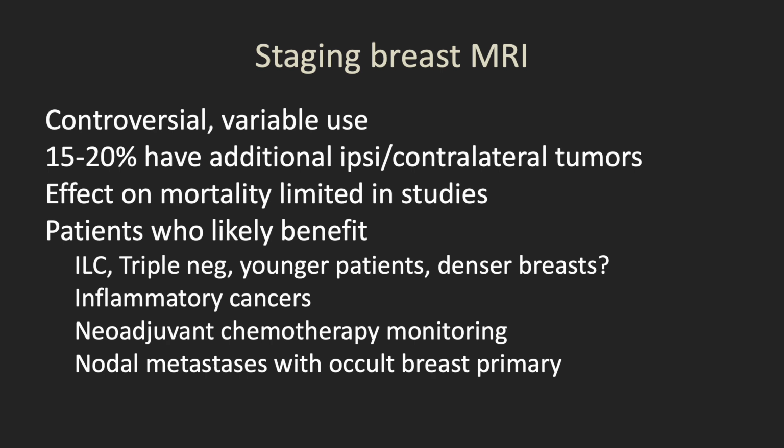So what type of patients would most likely benefit from staging breast MRI? Those with invasive lobular cancer, because we know that this is frequently multicentric, and it frequently is occult on conventional imaging. Patients with triple negative cancers, younger patients, possibly those with denser breasts, patients who have inflammatory cancers, patients in whom neoadjuvant chemotherapy is planned for monitoring, and then those patients who present with axillary nodal metastasis with an occult breast primary on mammography and ultrasound.